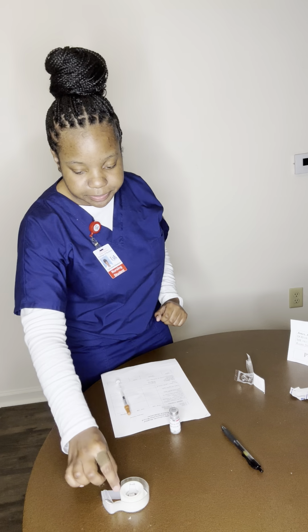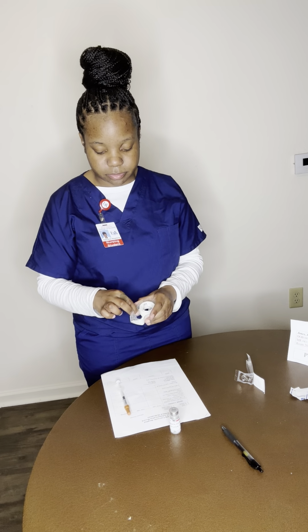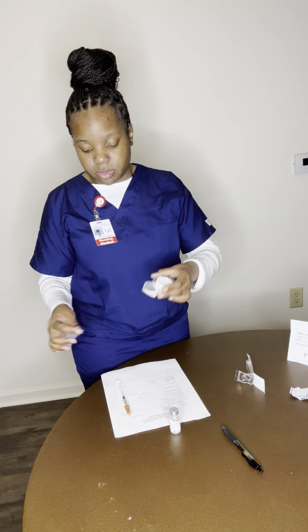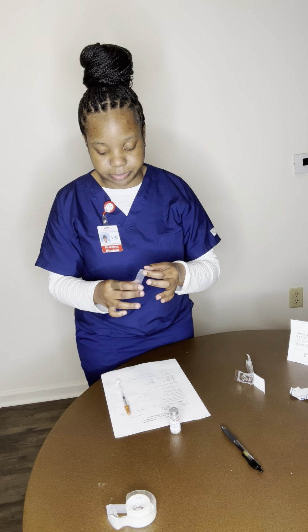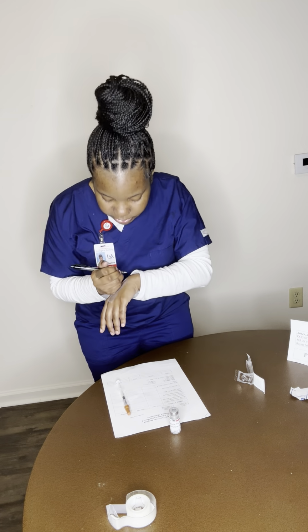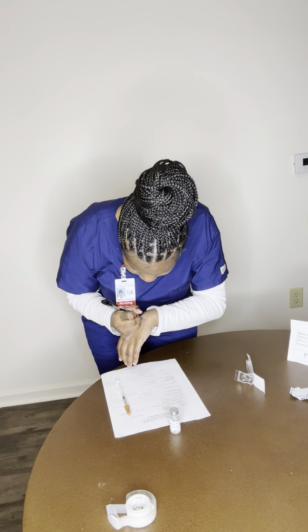So now I am going to take the tape, and I'm going to label my syringe. This is for patient Jaguar Jones.